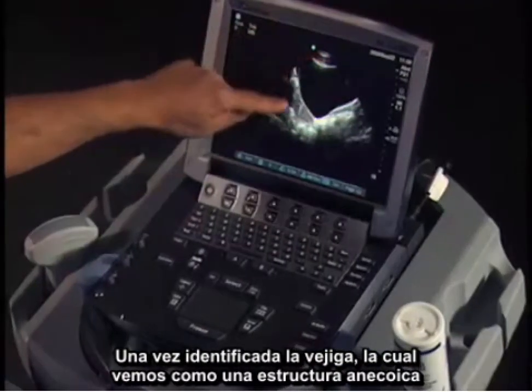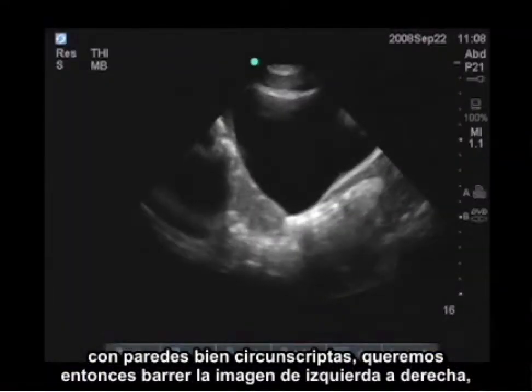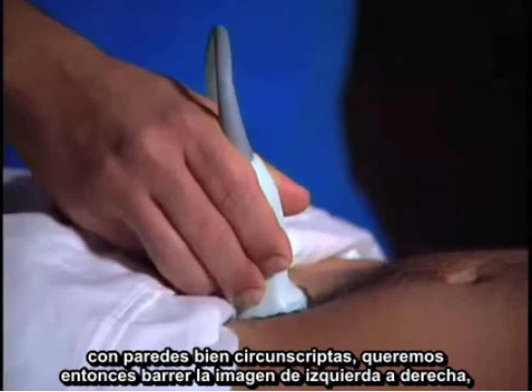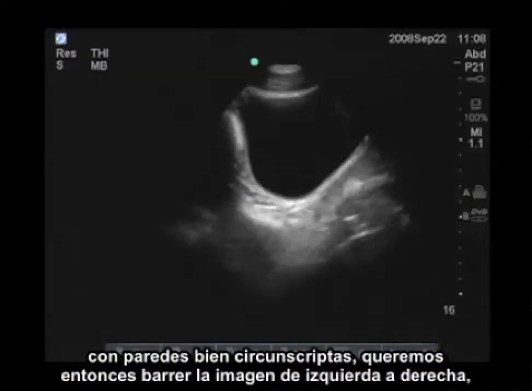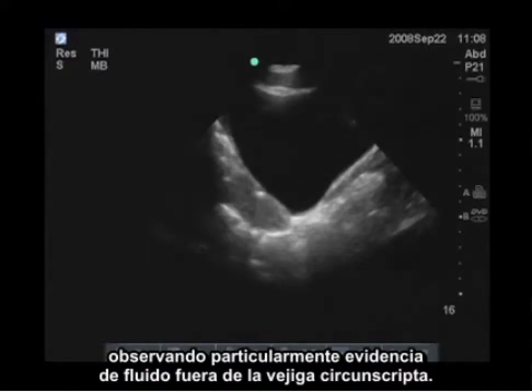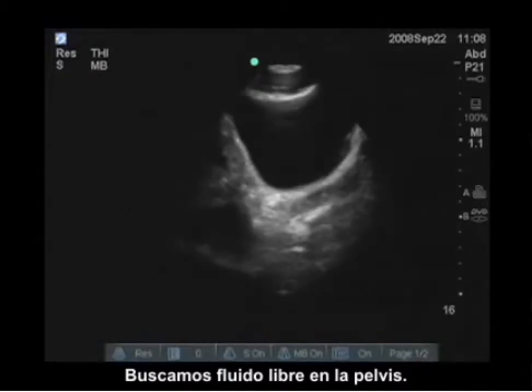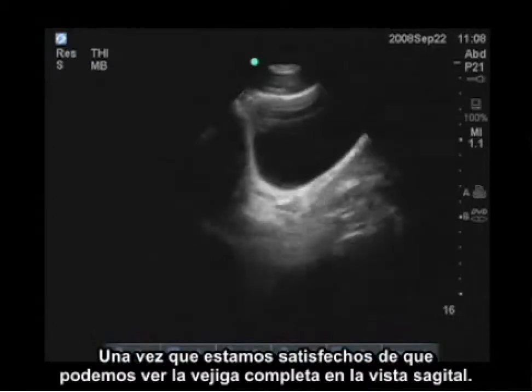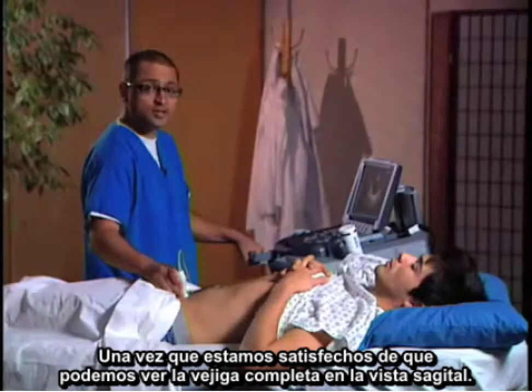Once you identify the bladder, which we see as an anechoic structure with nice circumscribed walls, you want to then scan from left to right, looking particularly for evidence of fluid outside of that circumscribed bladder. So we're looking for free fluid within the pelvis.